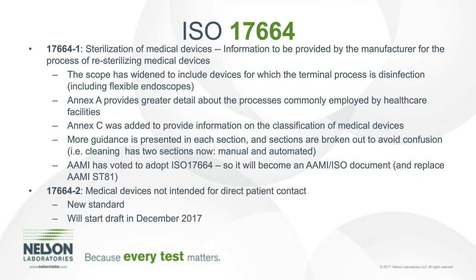Annex A provides greater detail about processes commonly employed by healthcare facilities. Annex C was added to provide information on the classification of medical devices, and more guidance is presented in each section, and sections are broken out to avoid confusion. For example, the cleaning has two sections. Now it has a manual and an automated section. They have great details on what those contain. This ISO was also voted, so it will become part of an ISO document and replace ST81.